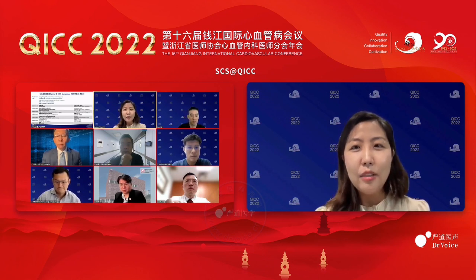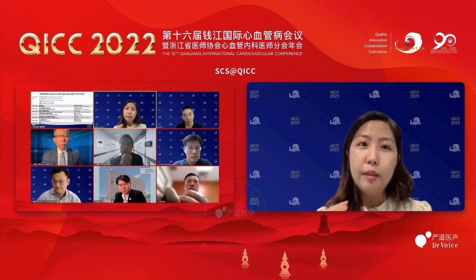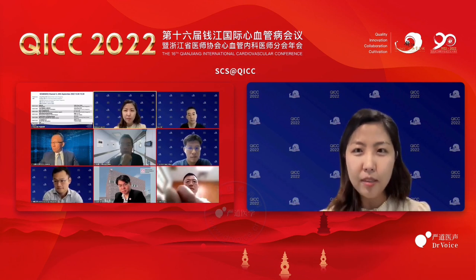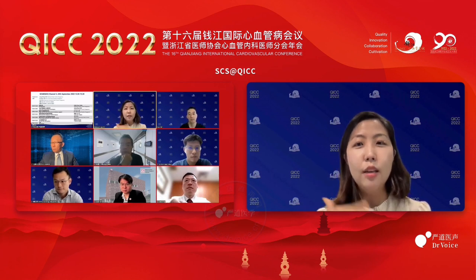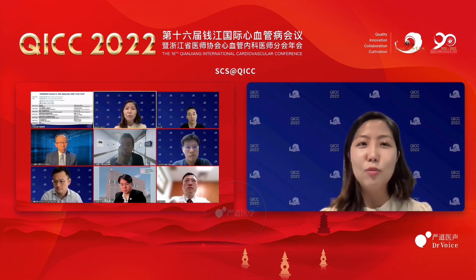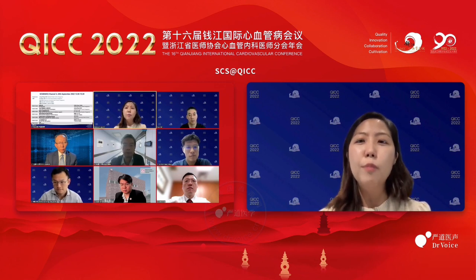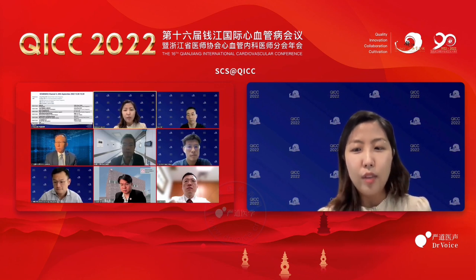So basically they get the baseline right heart readings before the procedure. And then they put in the Impella, and every power level they go up from P2, they repeat the readings after 15 minutes. And then when they go up to P4, they do the right heart reading again, P6, P8. So they want to see the effect on hemodynamics that this MCS support gives. And even in the weaning phase as well, they will do all these right heart readings religiously. So I think more data will come from Protect 4 about the hemodynamic effect of the MCS.